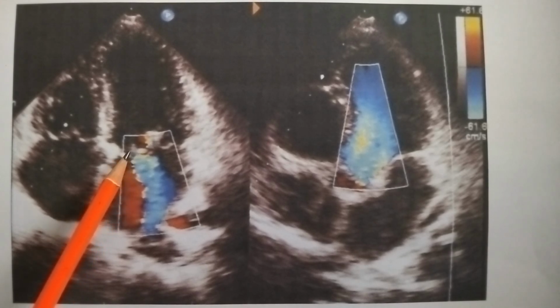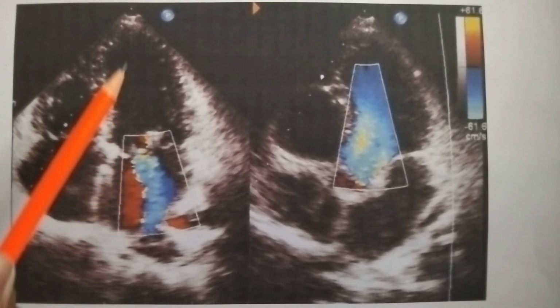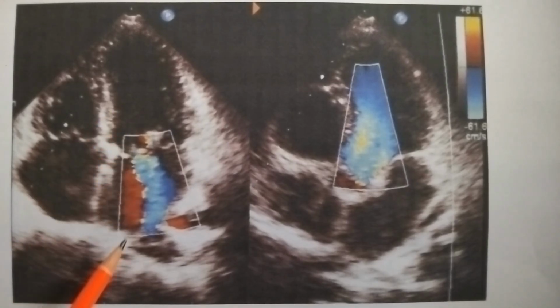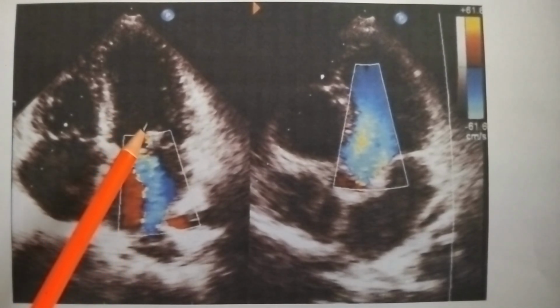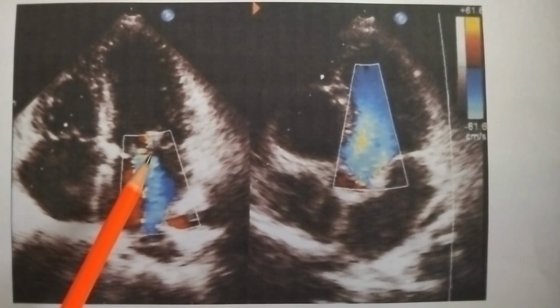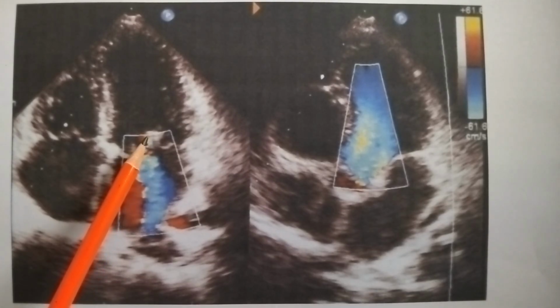Mosaic is turbulence due to the high velocity. When the left ventricle contracts, when there is mitral regurgitation, there is a high velocity jet. It's reaching up to the pulmonary veins, very prominent jet. This is mitral regurgitation jet. Here you have a flow acceleration beyond the mitral valve.